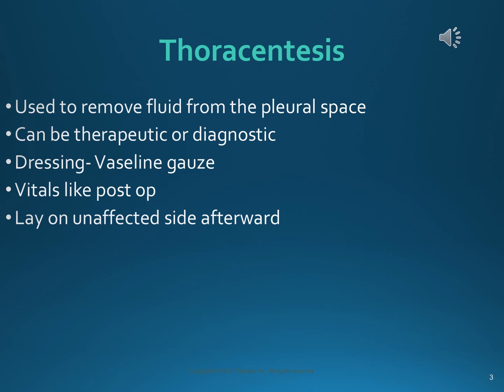This is done with a local anesthetic. It's a large bore needle and it's inserted from the back. There's a diagram here in a little bit. When it's over, the dressing is Vaseline gauze.